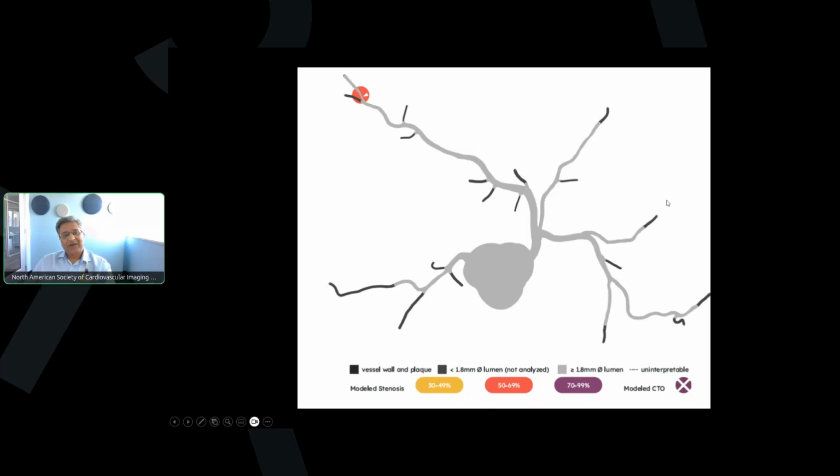This is an image from the same patient at the time of follow-up imaging. This is if you have used HeartFlow. This is the roadmap that comes with the coronary CTA. So you can see there is no obvious stenosis in any of the big arteries, though there is suggestion of decreased flow or low flow, which could be hemodynamically significant stenosis further distal to the LAD territory. And because this was so far away and not really concerning, they did not really do anything about this. The plan was to just follow up.